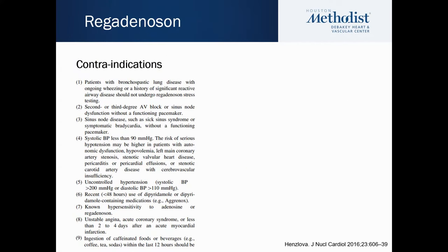In general, these drugs are very well tolerated, but there are some contraindications that we have to be aware of, and those are simply effects on other adenosine receptors. So if your patient is actively having bronchospastic disease, even though this is selective to the A2A receptors, you would proceed with caution. Similarly, if they have advanced degrees of AV block, these would probably not be good candidates for this test. And of course, if your patient is already hypotensive, these tend to be vasodilatory agents and will lower your blood pressure further.